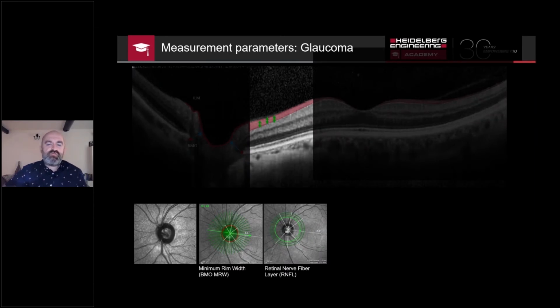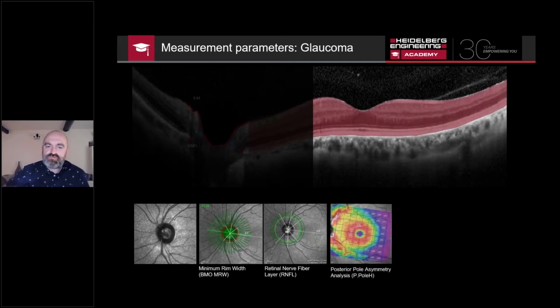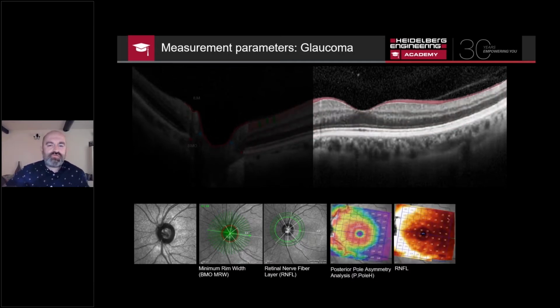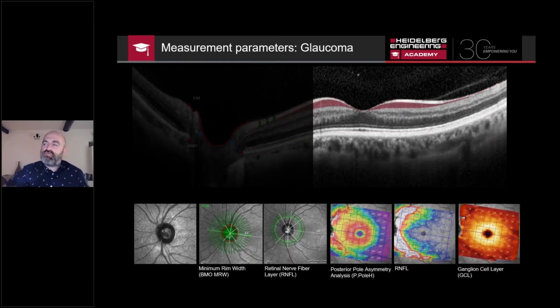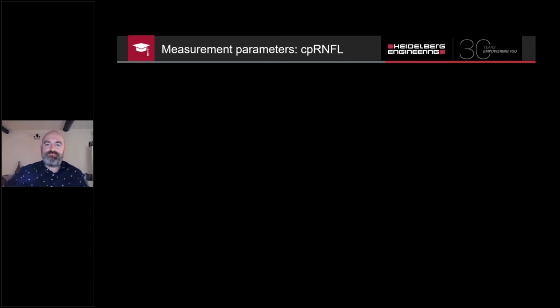And again, this is the very commonly used circumpapillary RNFL scan, which we're going to be talking about this evening. As we travel across the retina, that's where we start to look at the retinal thickness, and also we select out the nerve fiber layer from that structure and indeed the ganglion cell layer itself. What's new to our technology over the past year really is we've now released normative data for both the macular RNFL and of course the ganglion cell layer. I'll come to normative data in a moment.